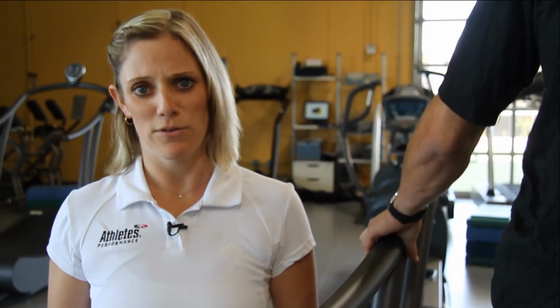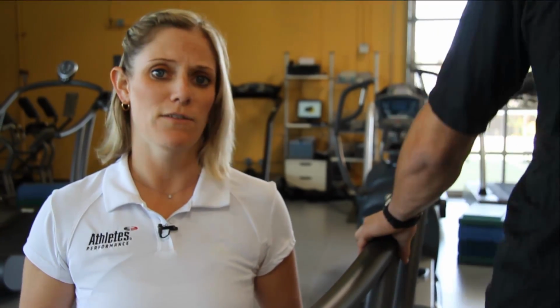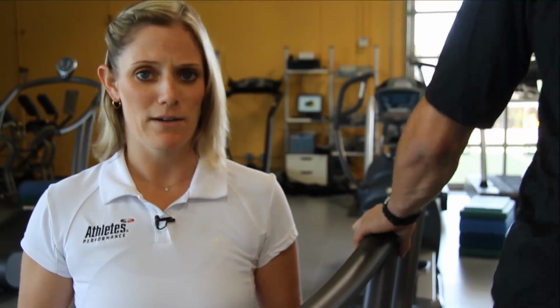A common dysfunction that we see with single leg stability, whether it relates to walking or running mechanics, has to do with the ability to bear weight on a single limb. And in order to do that, we have to be able to shift or translate the pelvis laterally over the femur with each step, with each weight bearing. Because of weakness in the deep hip rotators and the glute med, this can become very difficult for patients, again coming off especially of post-op scenarios or with altered or limited weight bearing capacity.